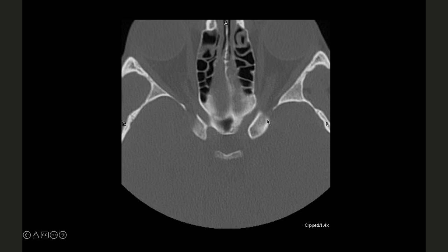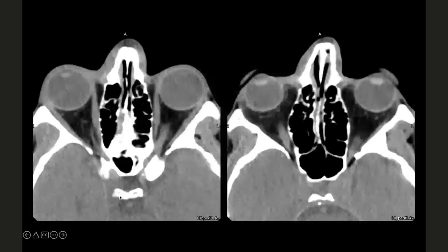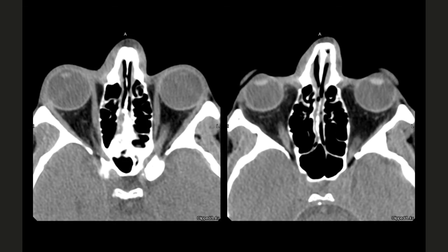And again, the optic canal, I see the orbital fissure. You're getting here into the suprasellar region. Once it comes here, this is when you start seeing your chiasm and it goes into your optic tract. But look at this. MR is going to show your chiasm and the tract so much prettier than this, because MR is good for soft tissues.